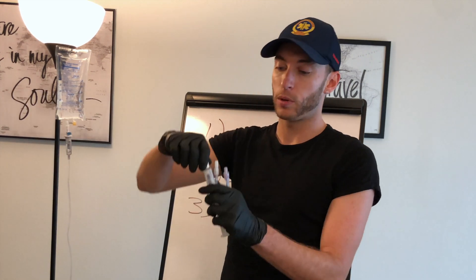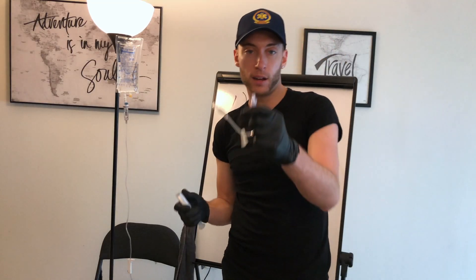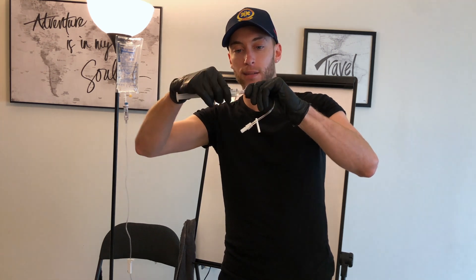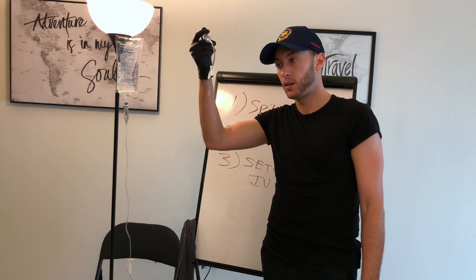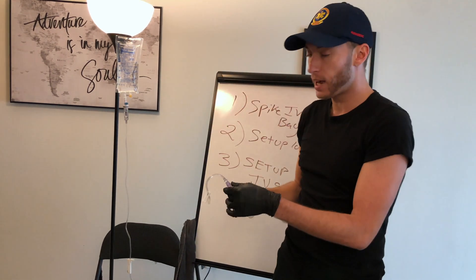So what we're going to do is take our cap off. Now I'm going to go right here and twist — push in and twist until I can't go anymore. Now I'm lock and loaded, ready to go. I'm going to push in. See the drips? And you can see there are no bubbles in that — totally clean. This lock is ready to go.